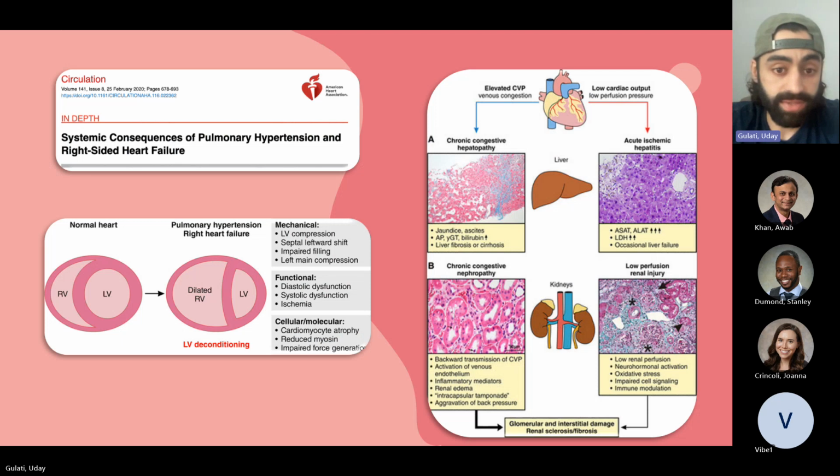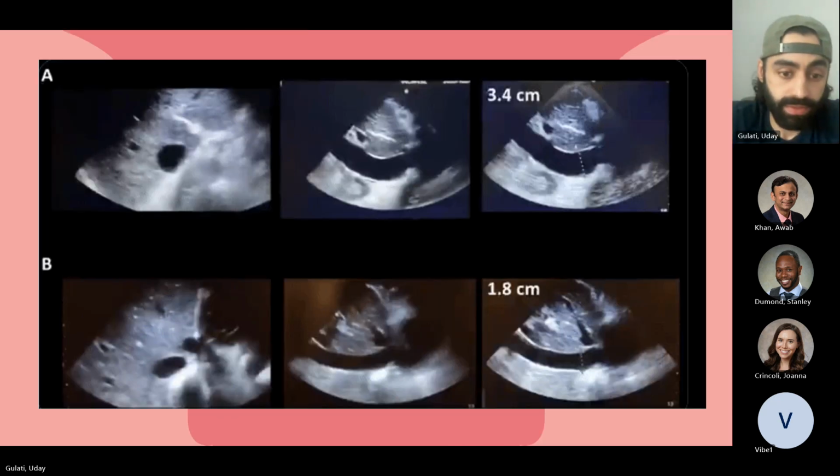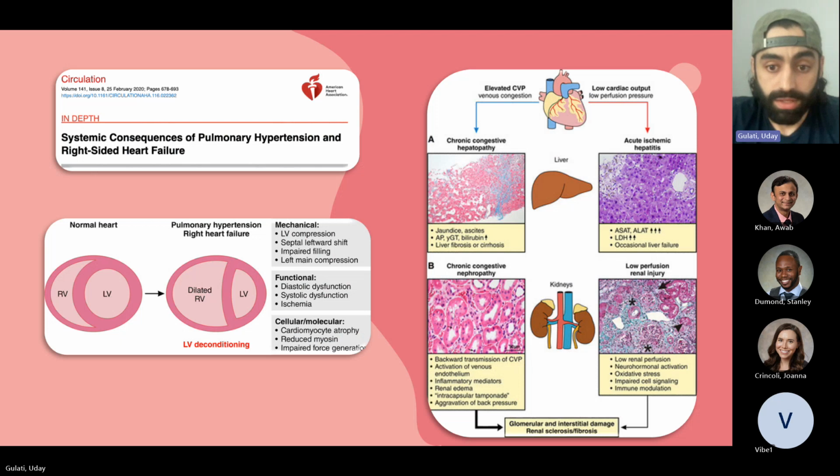And so the way to answer that question... sorry, go ahead. B. Patient B. So you are saying that you want to go ahead and give fluids to patient B, I'm guessing because their IVC diameter is smaller, is that correct? That seems to be the consensus. Okay, all right, let's go and find out what happened with this patient. We'll come back to the answer.